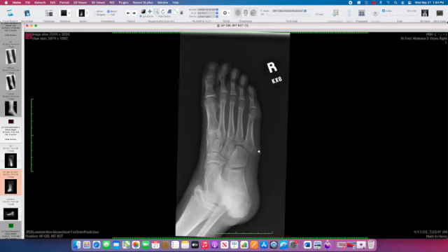This patient is skeletally immature, so we know this is an apophysis, a normal growth center at the base of the fifth metatarsal.